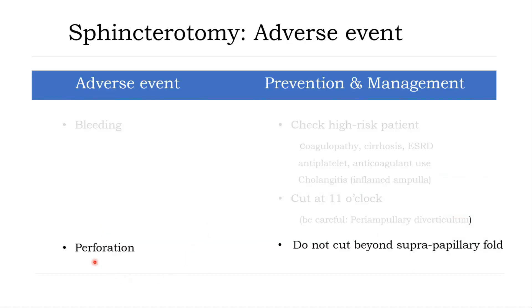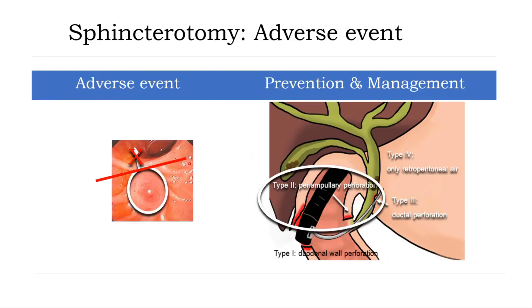The best way to avoid perforation is to not cut beyond the supra-papillary fold. Do not go beyond this area — this type of cut leads to perforation.